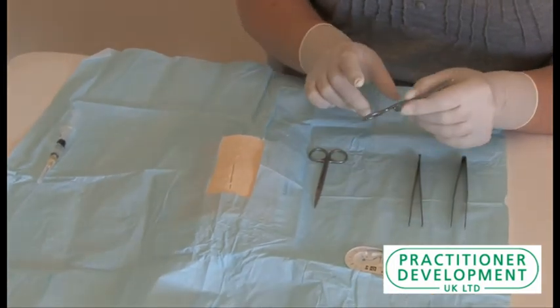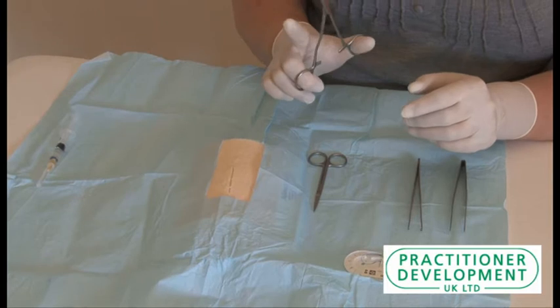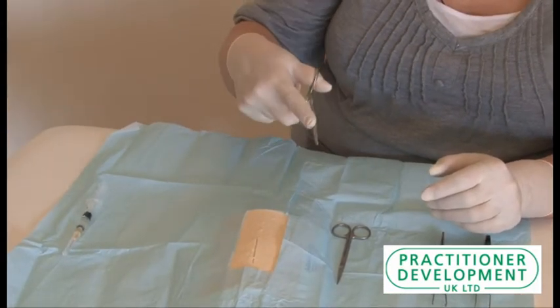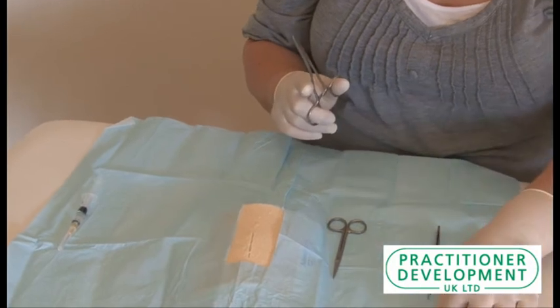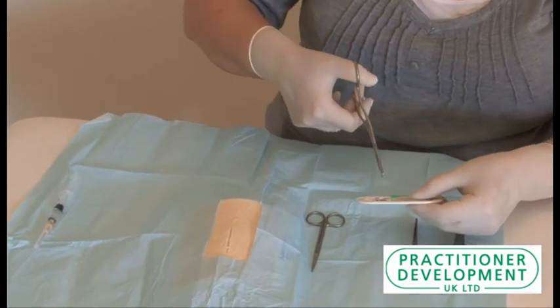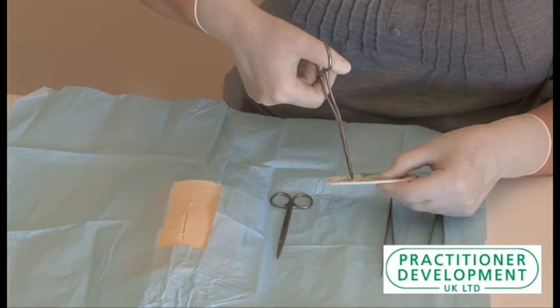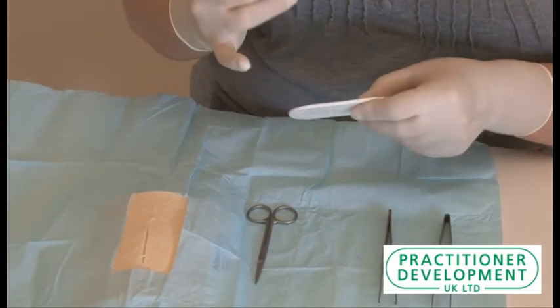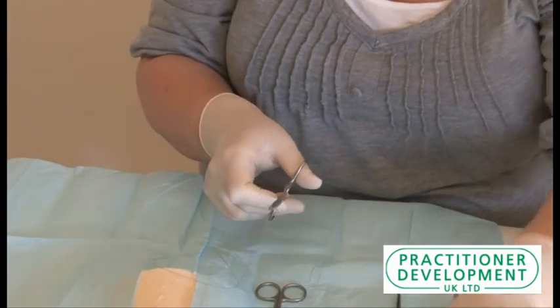The needle holder should be held between your thumb and middle finger with your index finger free to guide. So we're going to pick up the ethylon and I'm going to get hold of the end of the needle with the end of the suture holder.